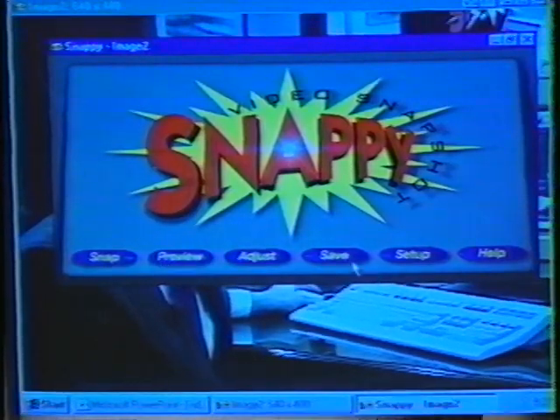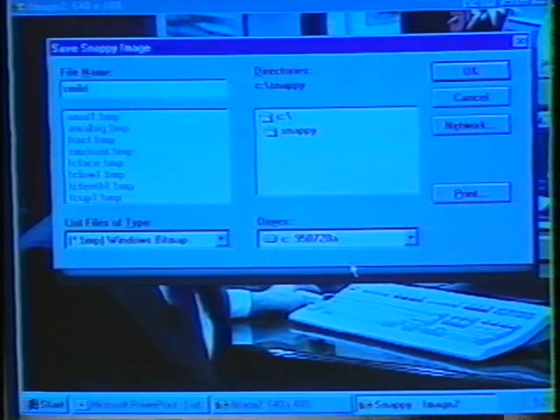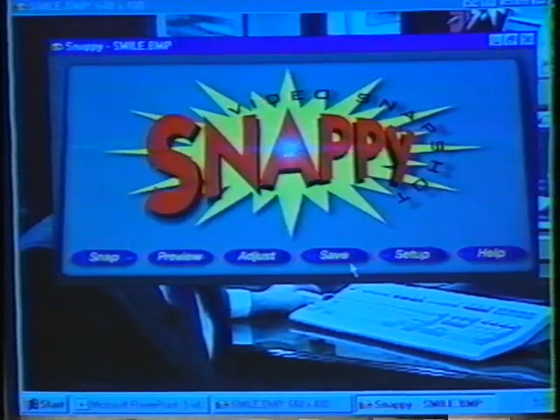Now, let's say we want to save this and put it in our slide presentation. We say Save. We'll call it Smile. And that's now been saved and stored.